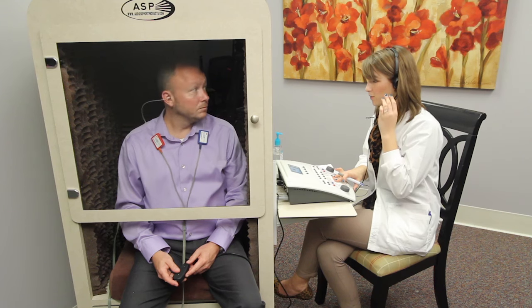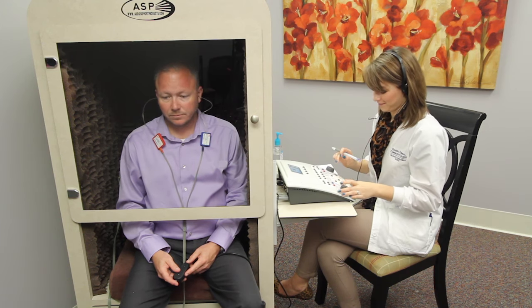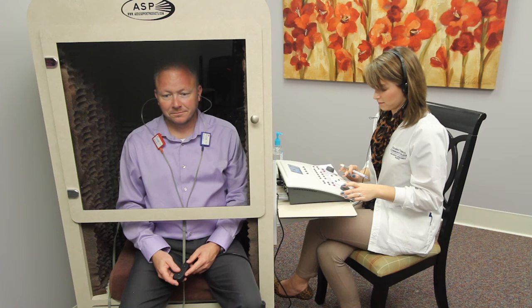Mr. Ruth Buck, can you hear me? You're doing great. Now we're going to move to your left ear. Do you have any questions for me? On the left side, we're going to do the same thing — we're going to start at 1000 Hz, work our way up, come back and verify, and then do the lower frequencies.